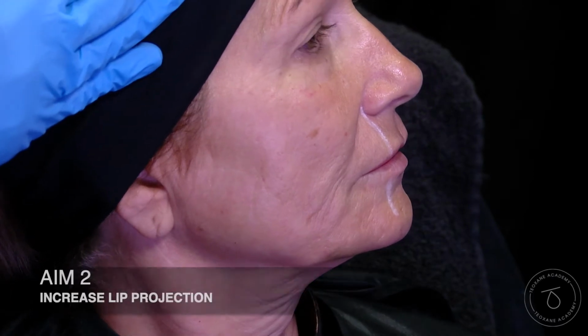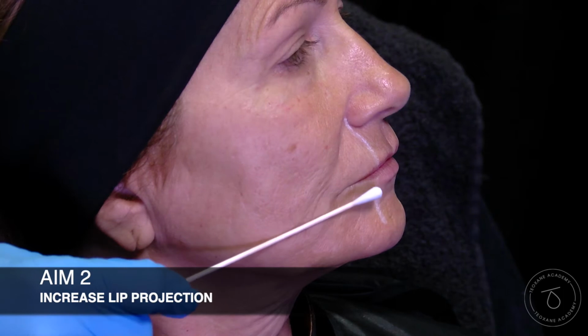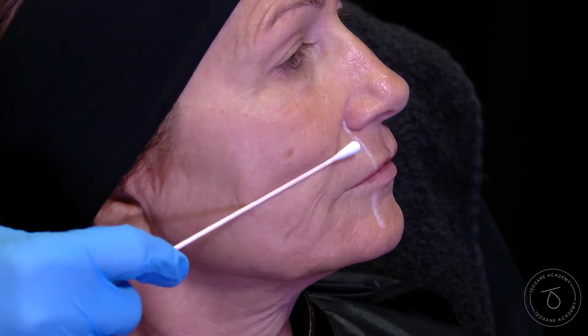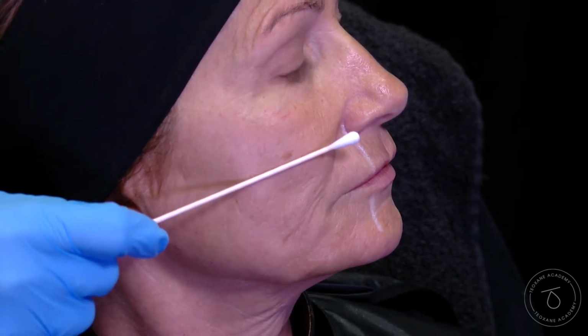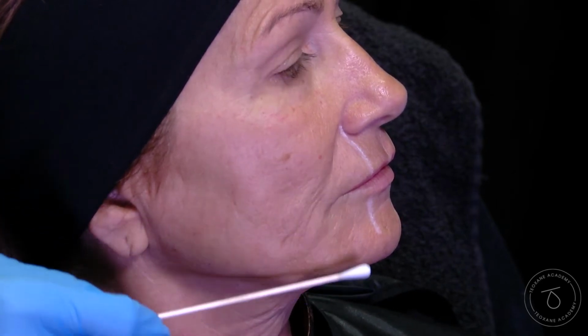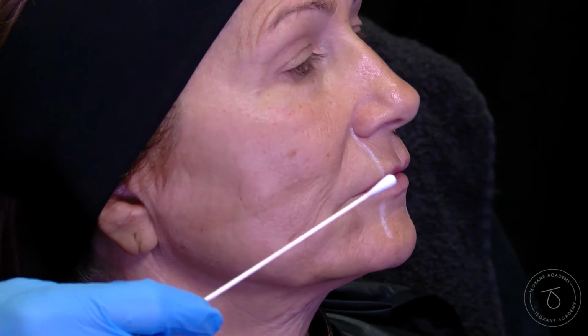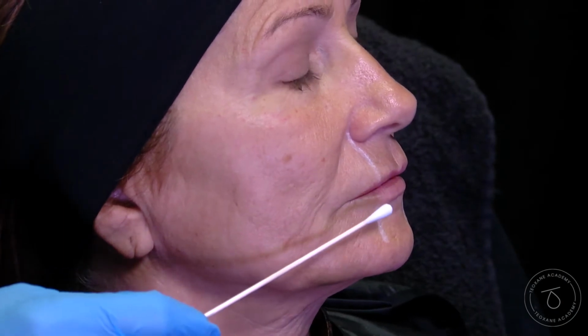If we manage to get a lateral view here, guys, that would be amazing. No, there we go. So she's asking for a bit more projection, especially here in this lower lip, and also volume. If we have a look at her thirds here in the lower third of her face, it does respect, you just have 1/3 to 2/3 going down here. So our aim will be to volumize both the upper and the lower lip and to give anterior projection, especially here at the GK point and of the lower lip.